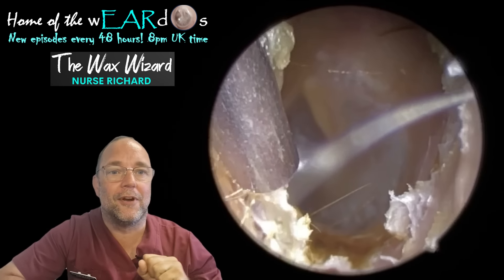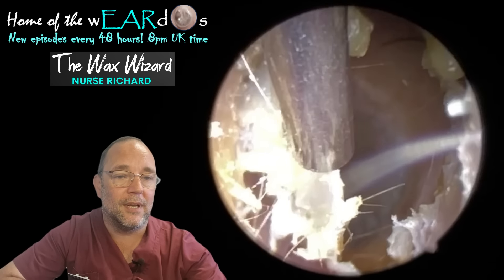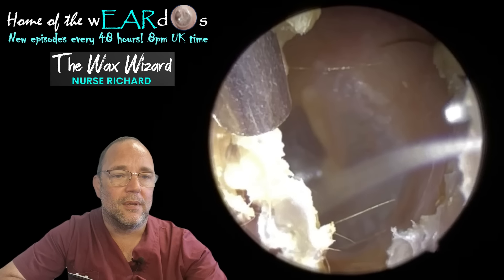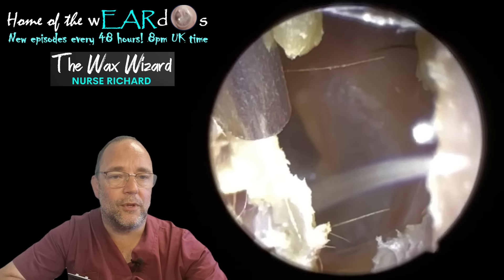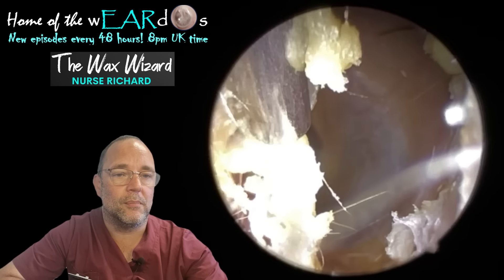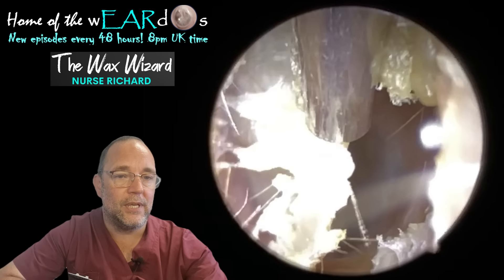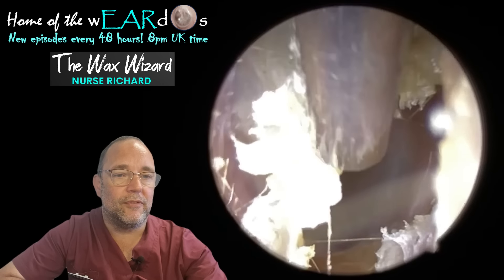Making me itch now just talking about itching. I think she has psoriasis and eczema, and you can get overproduction of skin quite commonly with those conditions, which makes this thing really thick and quite difficult to peel away. I think we had to go to some oil in a bit, which did help because I've got the fine end tube — it's always best for peeling, but it's extremely thick.